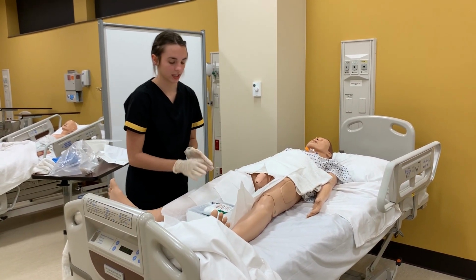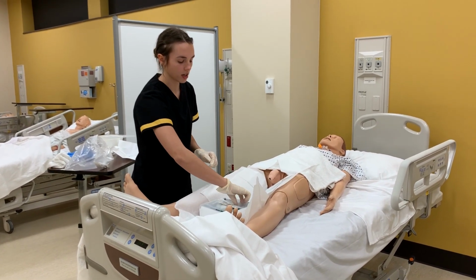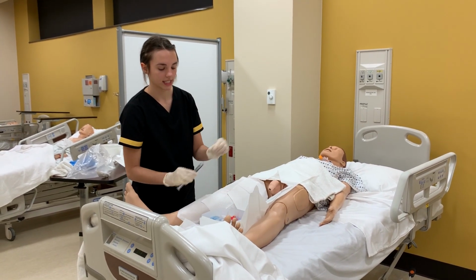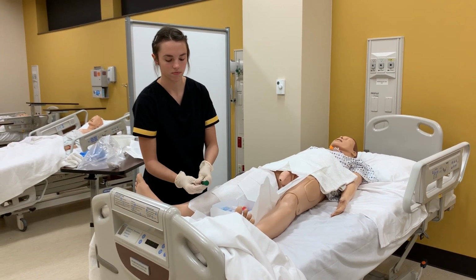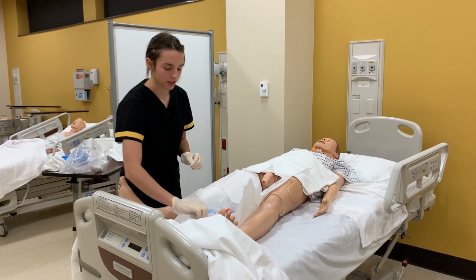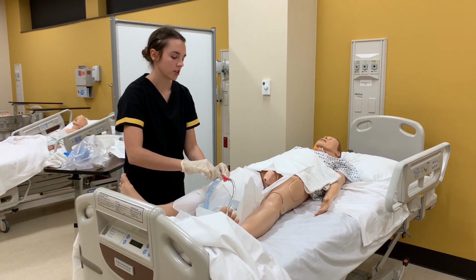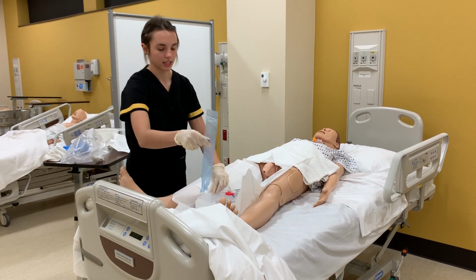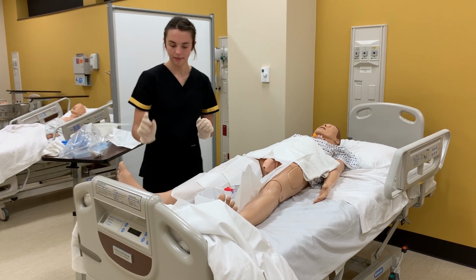Just like that, perfect. So now I'm just going to lay out my stuff, get it prepared. So we are going to take this little tray off. Go ahead and take the caps off of our syringes and toss it into the bin. Also, I would go ahead and connect my sterile water syringe to the port for the balloon that we're going to use in a minute. And then we can go ahead and take the plastic wrapping off, toss it.